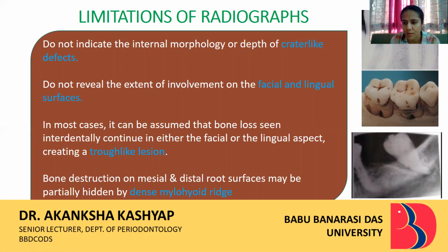So we assume that if interdental bone loss is there, the facial or lingual bone surfaces must automatically be involved. Also, in certain cases where the mylohyoid ridge is dense, the mesial and distal root surfaces may be partially hidden because of the dense ridge and the destruction.